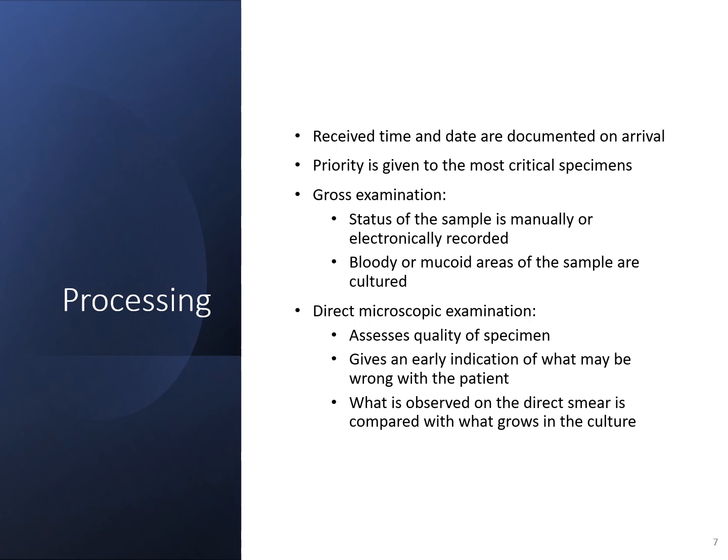You're able to assess the quality of the specimen. So with sputum cultures, you're looking for a quantitation of white blood cells and epithelial cells, to see if it's possibly contaminated. It also gives an early indication of what could be going on with the patient.